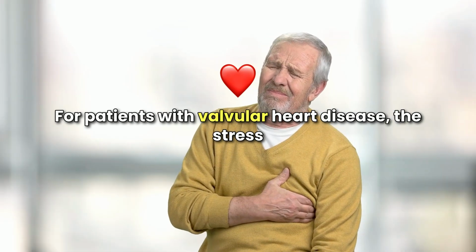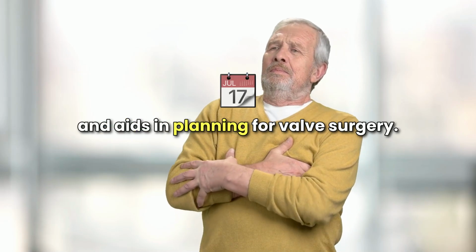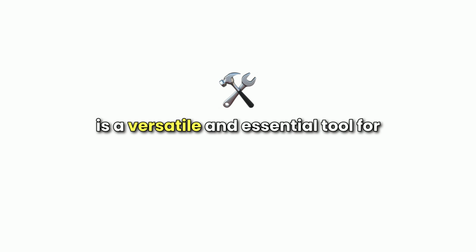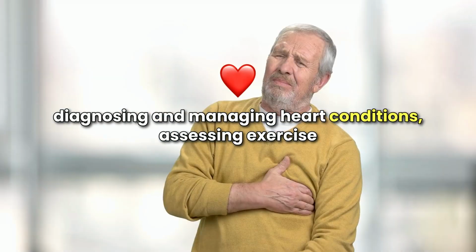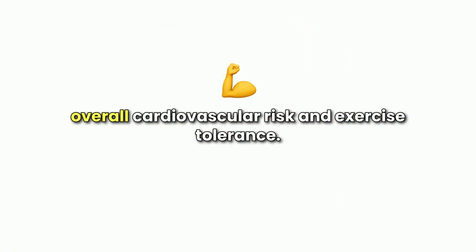For patients with valvular heart disease, the stress test evaluates how the disease impacts exercise capacity and aids in planning for valve surgery. In summary, the cardiac exercise stress test is a versatile and essential tool for diagnosing and managing heart conditions, assessing exercise-induced symptoms, guiding treatment decisions, and evaluating overall cardiovascular risk and exercise tolerance.